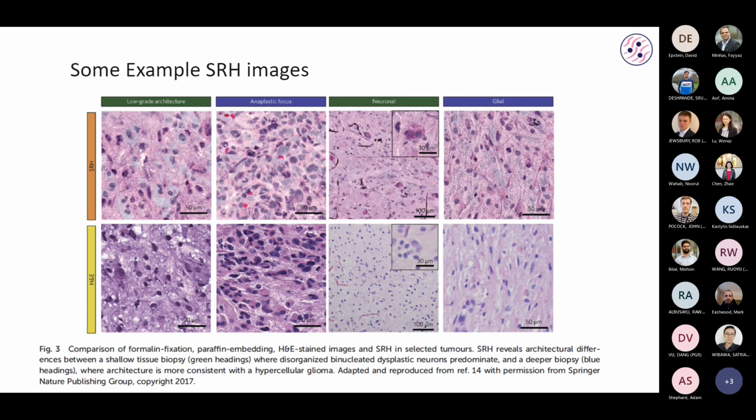There might be some standardization issues, like how bright your illumination is, or things like that. I'm not entirely sure. It depends on the setup of the light. I think there could still be some variation due to your exact microscopy setup, but it's significantly reduced.